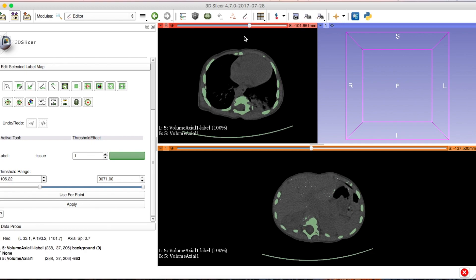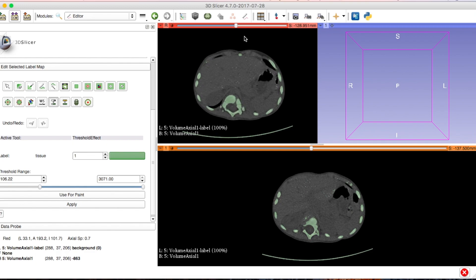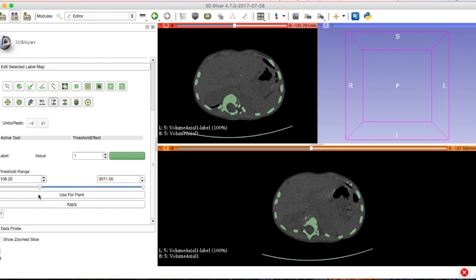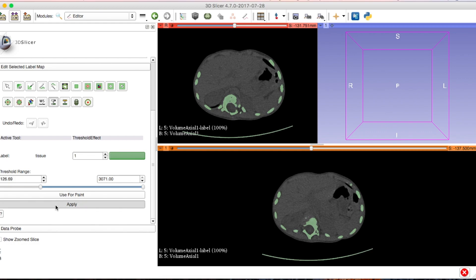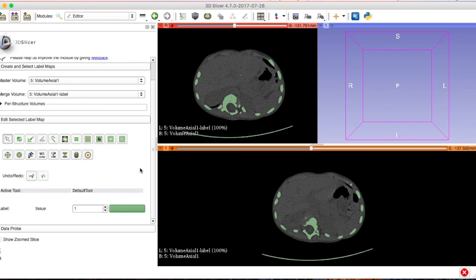Clearly there's too much showing, so scroll down and adjust the threshold boundaries. Always keep a note of whatever numbers you end up using, because it might be useful in the future if you ever need to go back to the original scan. Adjust those two numbers to make sure you don't have too much extraneous matter — just what you need — then click Apply. Now search 'Model Maker'.